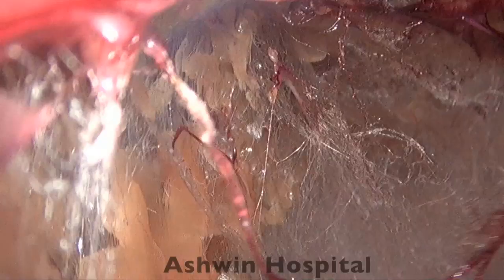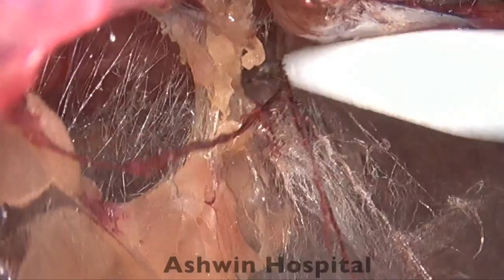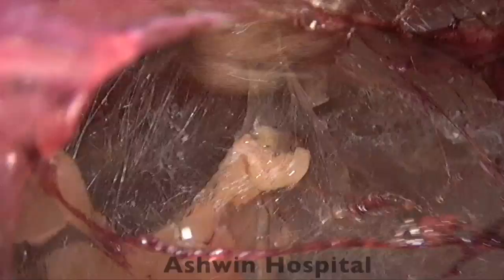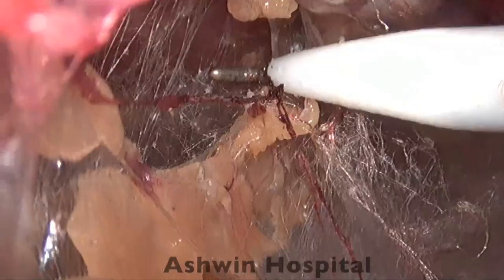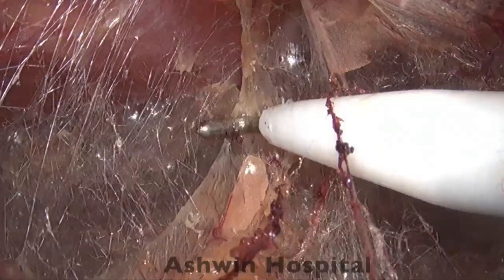Through the working port, now we will use a simple hook and start dissecting. You can see in the midline, the tissue is generally slightly fused, and you can see how the small fascial attachment is present in the midline. So we have to divide these tissues in a sharp manner by using scissors in a cold manner, or using a hook or some instrument with a little bit of cautery. And once we incise that fused portion, then the tissues on the opposite side also will be pretty loose, and it'll be a loose areolar plane which we have to dissect and open.